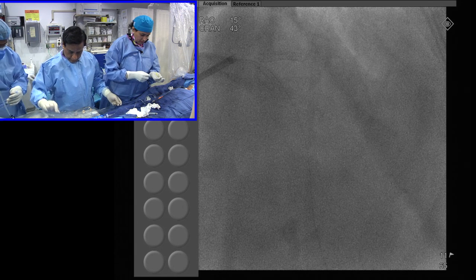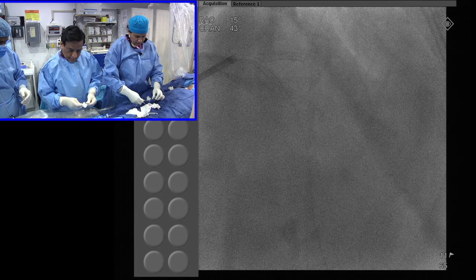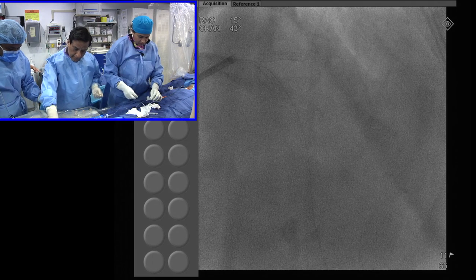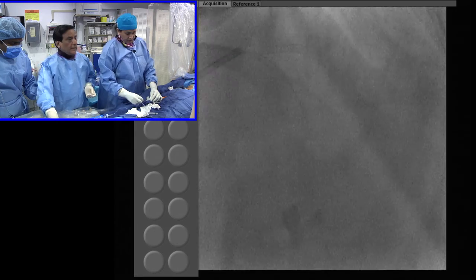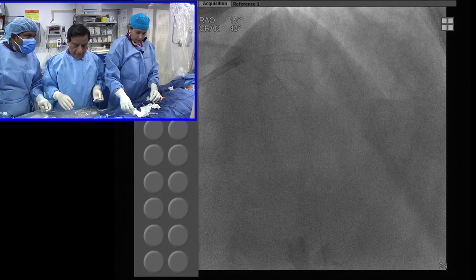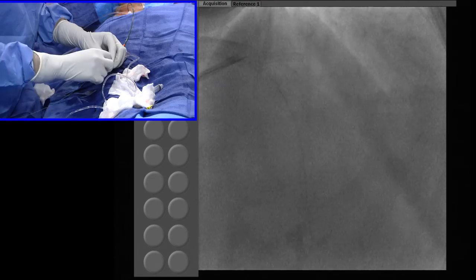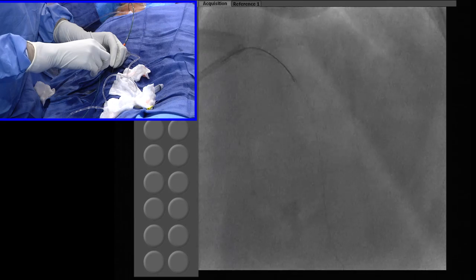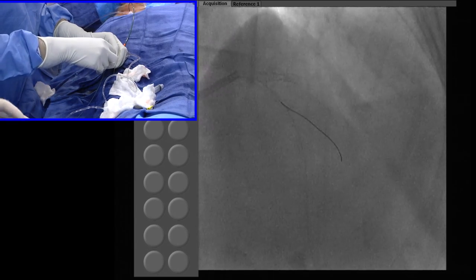Samin, you mentioned you've done 30 cases post-approval, and those 30 cases, most of them were the kind of complex cases we show. Actually, some of them are simple, easy, but of the 30, 10 are with atherectomy, and about another 6 are overlapping. And in bifurcation situations like this, none of the cases we have done have used 2 BVS.